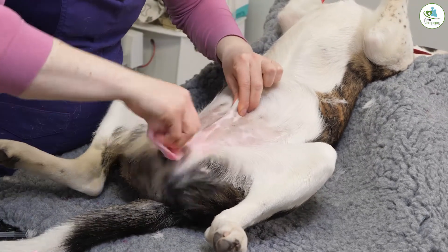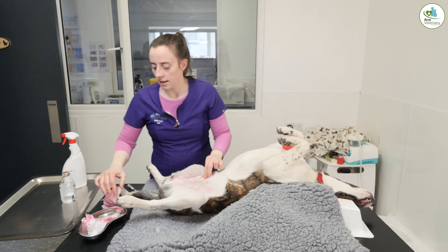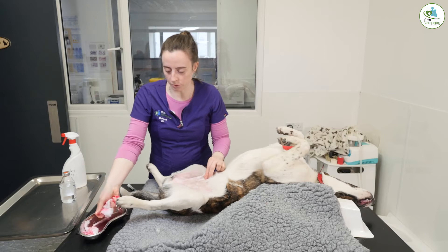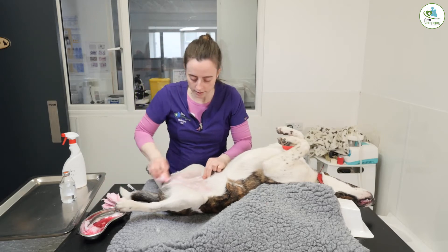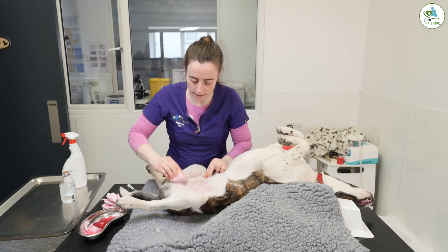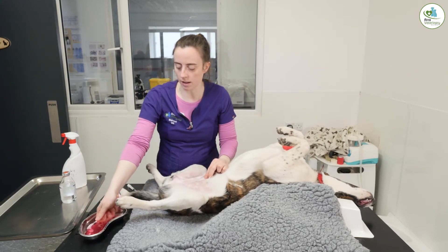This is exactly where our incision is going to be, so that is the cleanest area and we use every bit of it, even though we're getting clean cotton wool coming back. Cleaning is the most important part because it reduces the chances of infection.